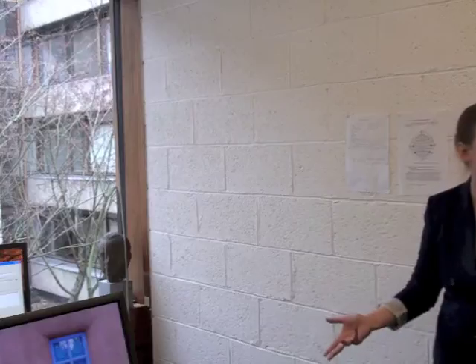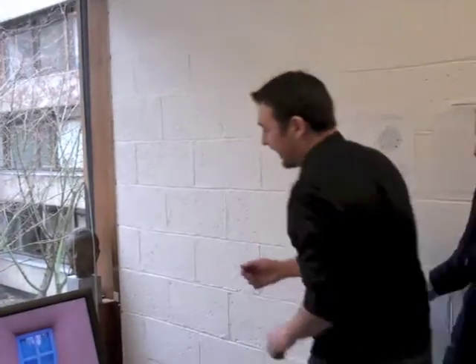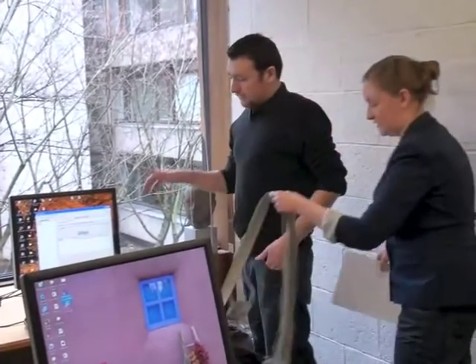So then it gets to the setup. Bren, do you want to do that? Now it's on tape. Bren, do you want to come and sit down? Yeah. Can I just ask? Yes. You're on.